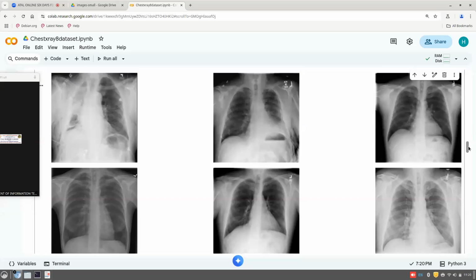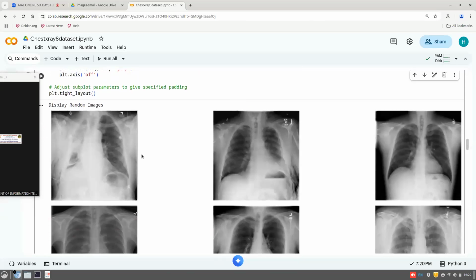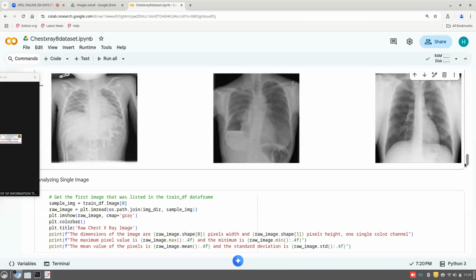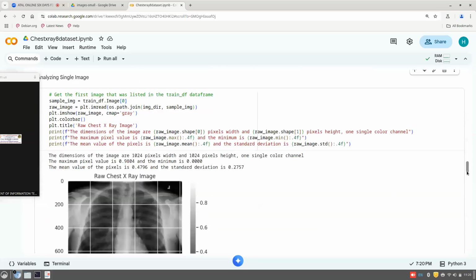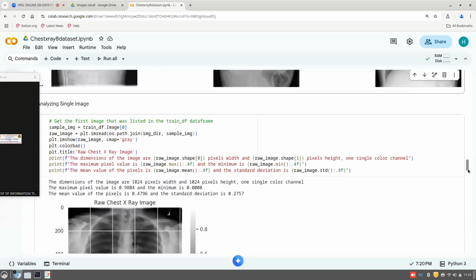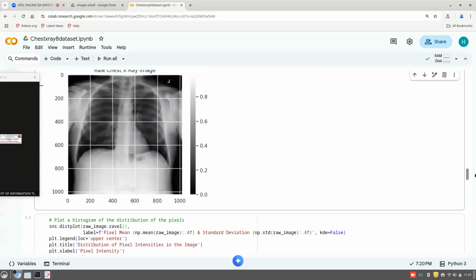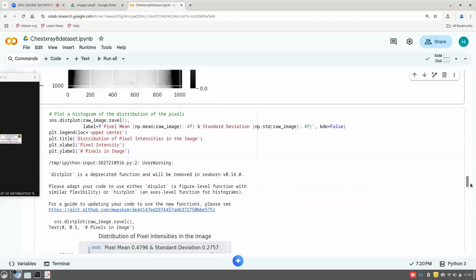So with support devices, all those things present. Here a tube is put over his chest. So like the different images you can see. Your objective will be to find out whether the X-ray is normal or abnormal and predict the disease manifestation associated with the chest X-ray images.